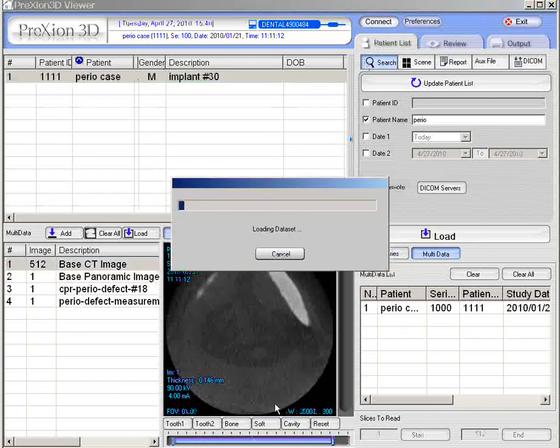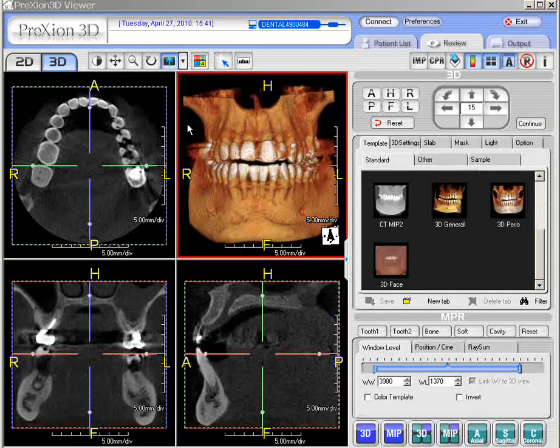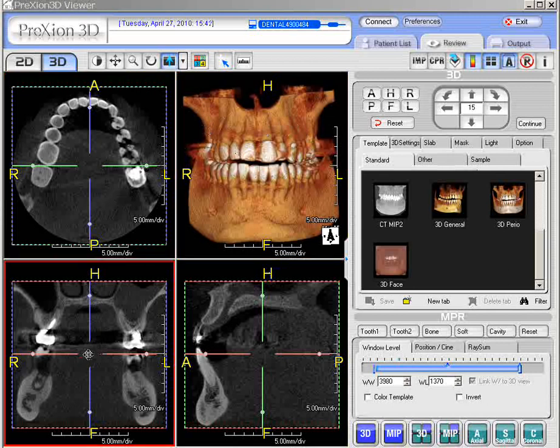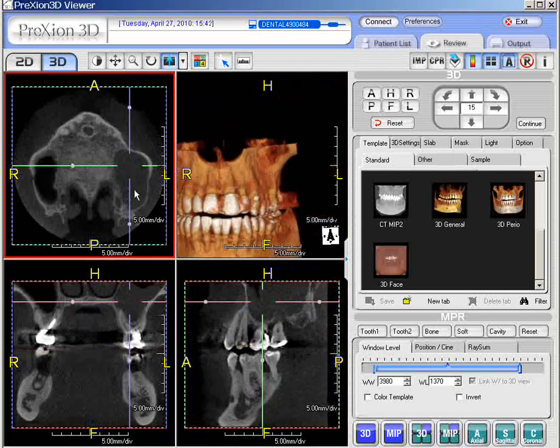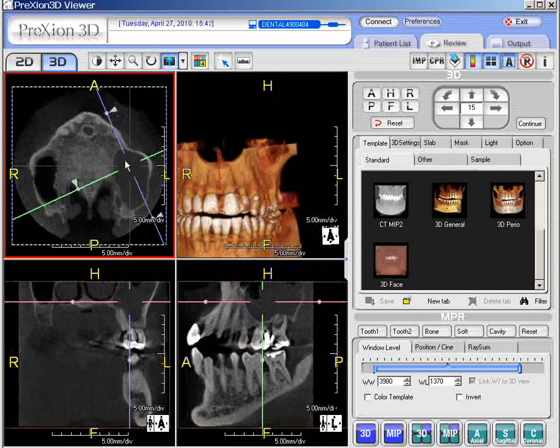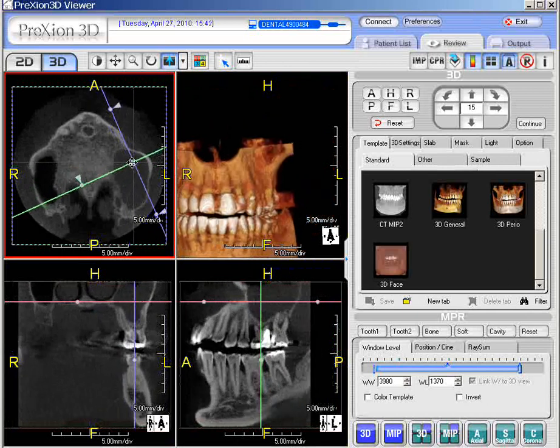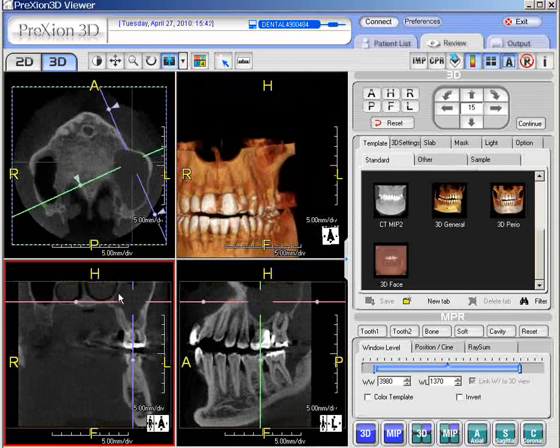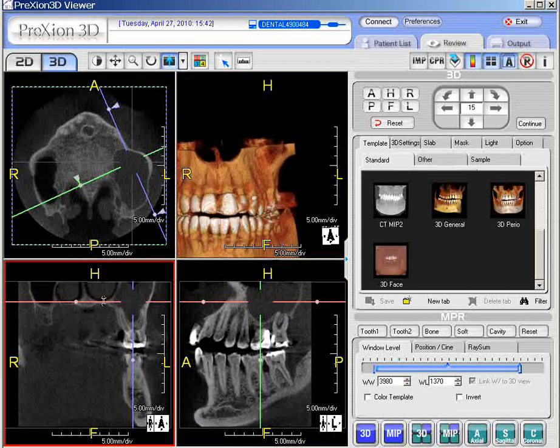We'll delete what's in the Output Panel for now. When you get the delete prompt, as long as you've done something with those images in the Output Panel — saved as a file or printed — then you can delete whatever is in the Output Panel. When you're in 3D mode with the coronal and sagittal screens, if you want to save a particular view, whatever highlight box your arrow is pointing to, you'll see a red frame around the outer periphery — that is the active box.